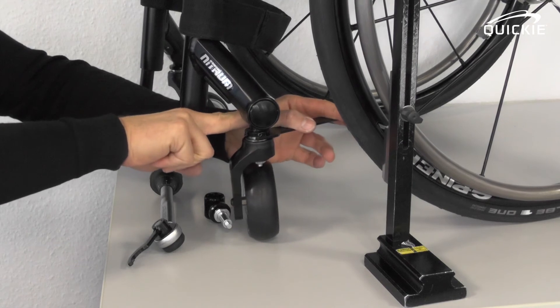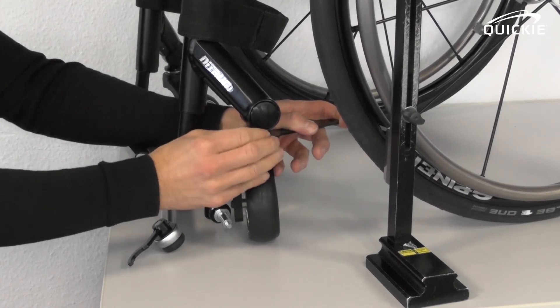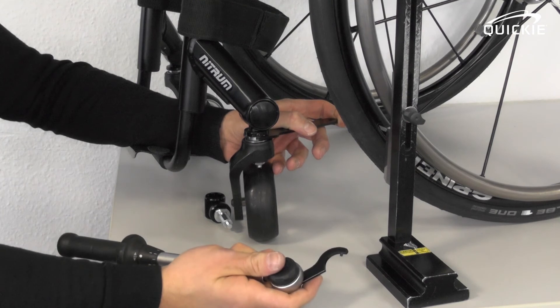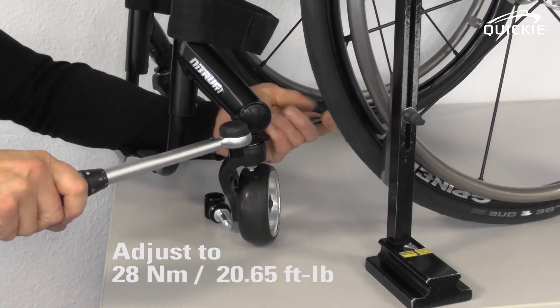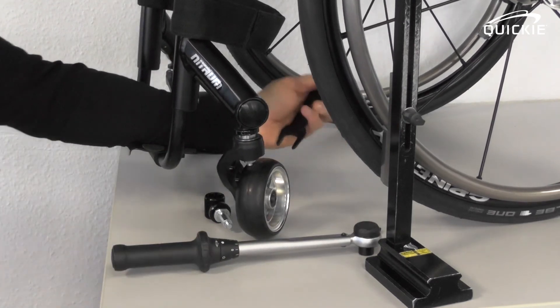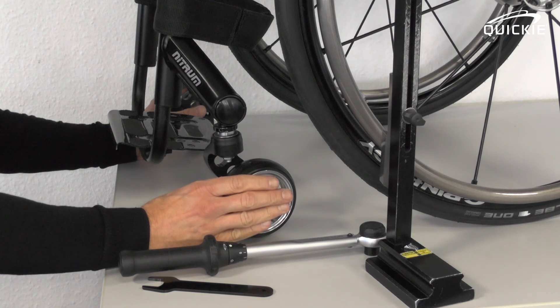Use the spanner to hold the position whilst you close the round nut. Start to tighten it by hand, then again use your wrench with the special tool. It's very important that you use a torque wrench to tighten it, because you need to adjust it to a torque of 28 Nm. Everything is back in place. You can see that all caster wheels touch the ground and the chair won't veer to one side again.